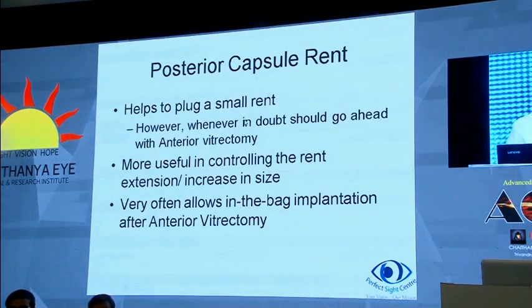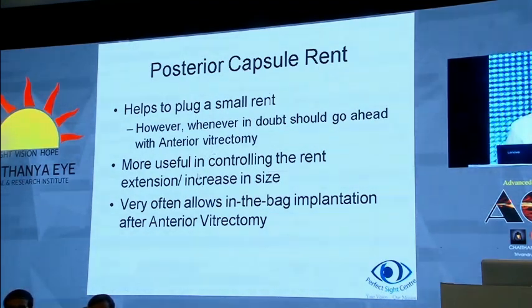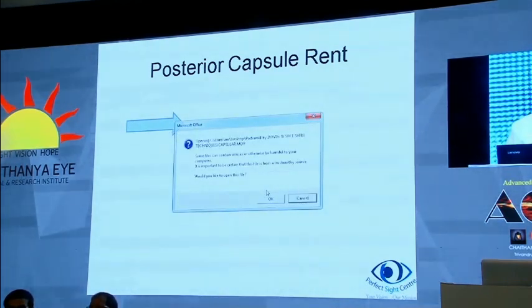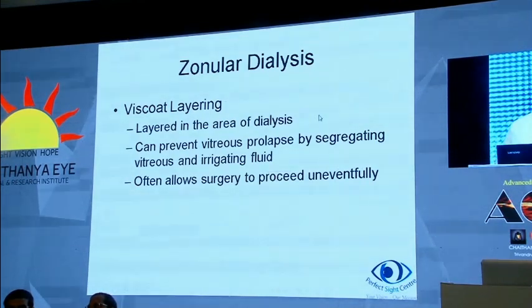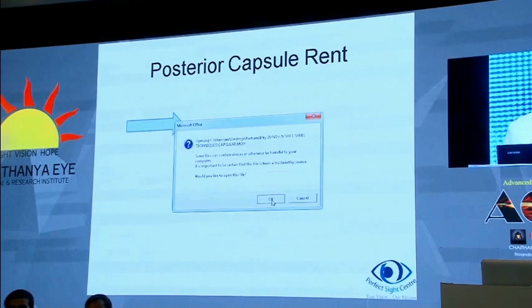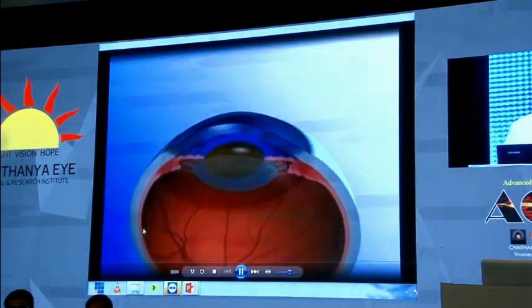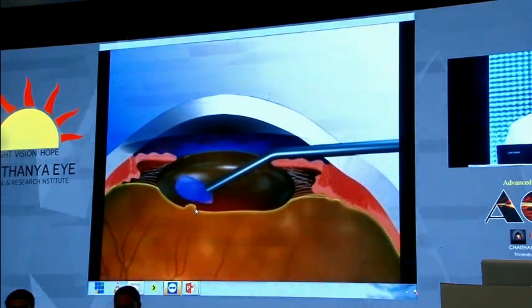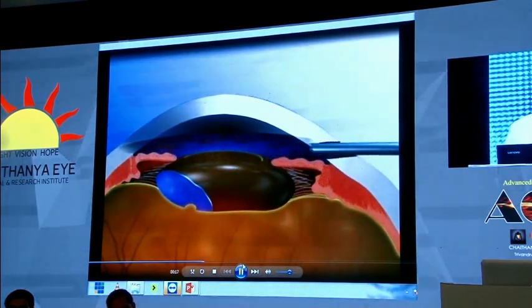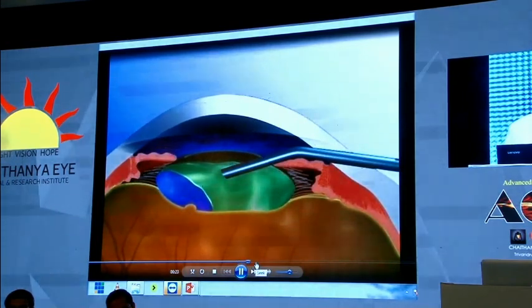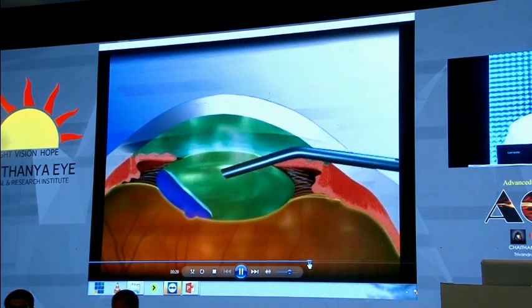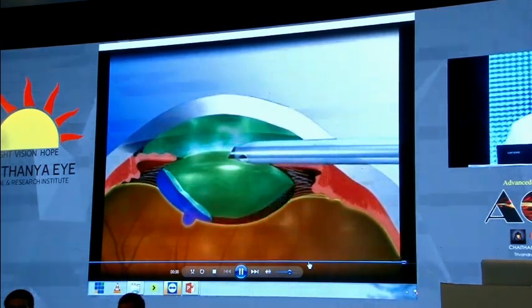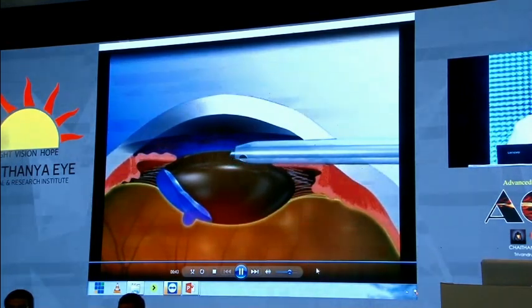In posterior capsule rent, Viscoat helps to plug a small rent. However, whenever in doubt, you should proceed with anterior vitrectomy. It is most useful in controlling the rent or preventing extension, and very often allows in-bag IOL implantation after anterior vitrectomy. Sometimes the procedure is near completion and at the last minute there is a rent — you can push in some Viscoat and place the lens, but more often than not there are nuclear pieces remaining, and it is always advisable to do anterior vitrectomy rather than just implant the lens, as that can cause problems.